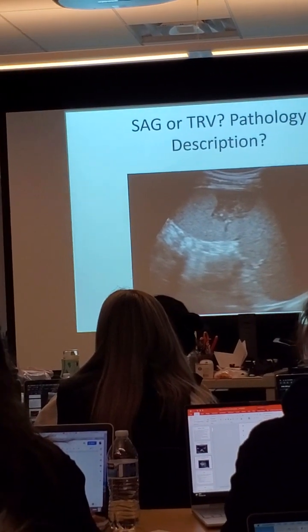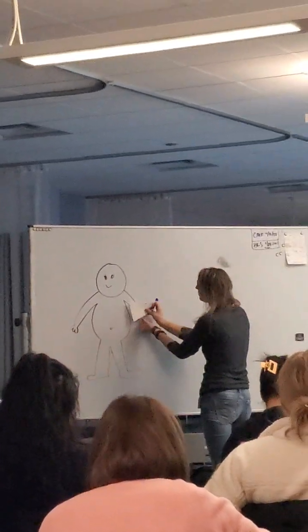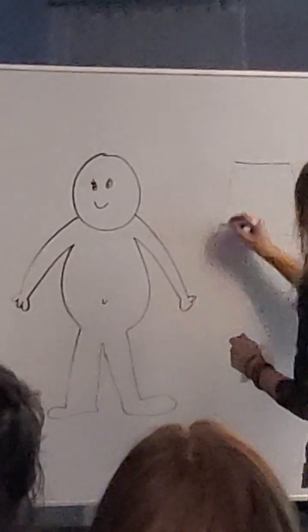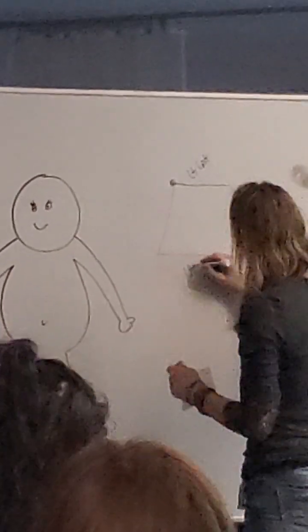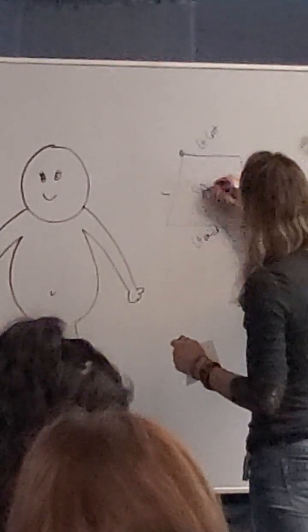So let's talk about some coronal movement. Okay, so here we are. We're scanning coronally from the left. So we're going to end up with the notch here. This is going to be left lateral, left medial, superior, inferior. So this is going to be for our sag spleen.